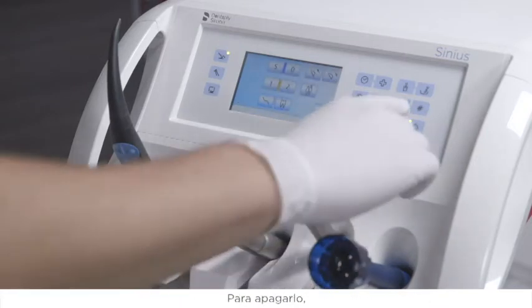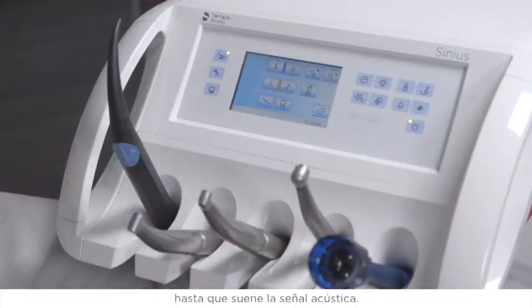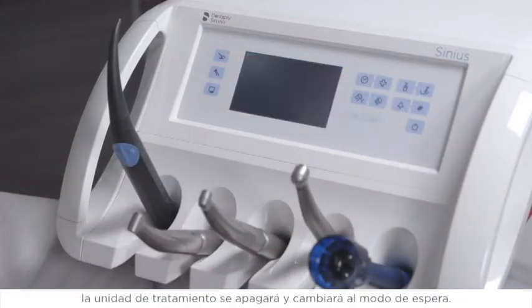To switch it off, press and hold the main switch on the dentist element until an acoustic signal sounds. Then release the button. The treatment center shuts down and switches itself to the standby mode.